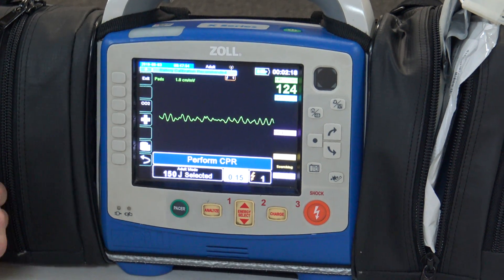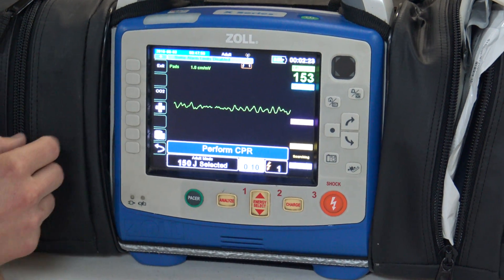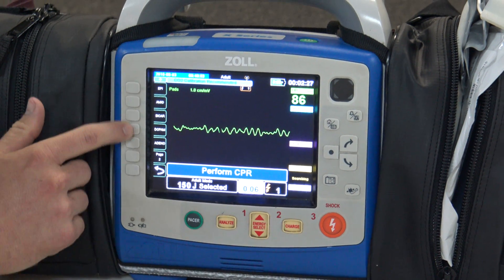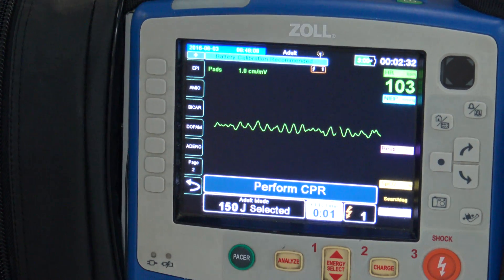Another thing to notice is that we still have the ability in AED mode to check the drugs that we've given. If we've given an epi, we can go ahead and time stamp that and it will record it in our code summary.